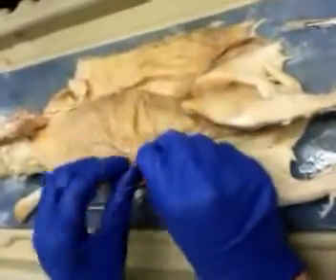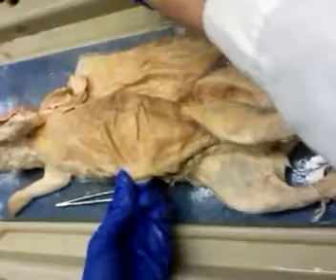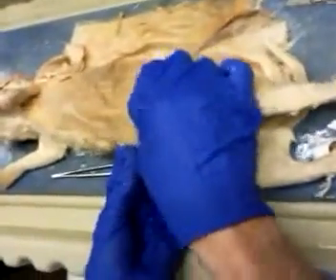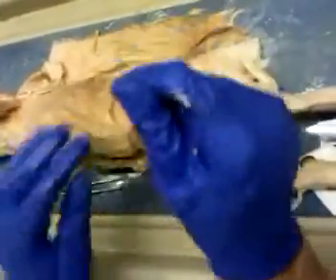Okay. Now I need to make a window here. That's just connective tissue. Anything that's white like that, you just pull off. Connective tissue. More there. There are 3 layers in here, and it's only, no thickness at all.